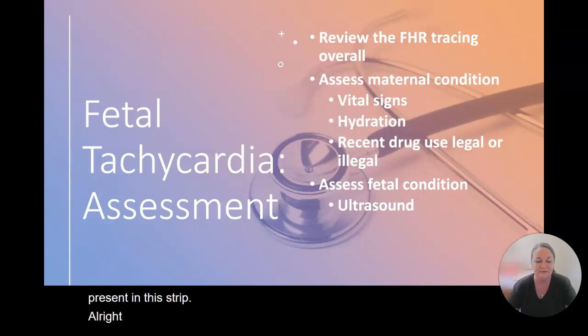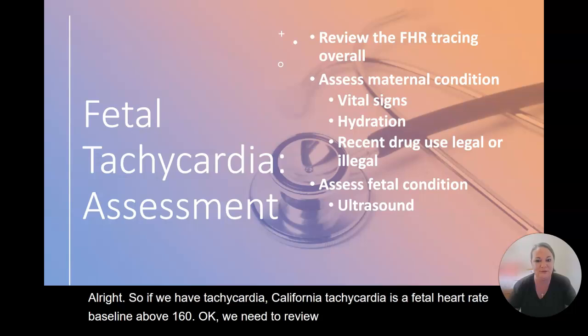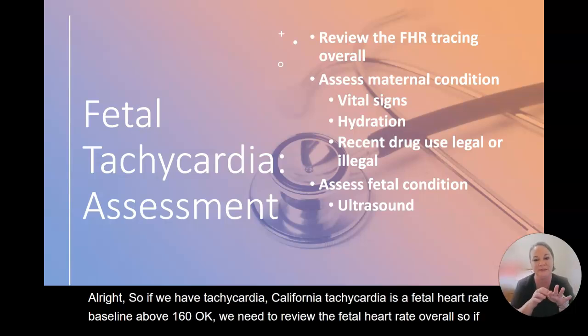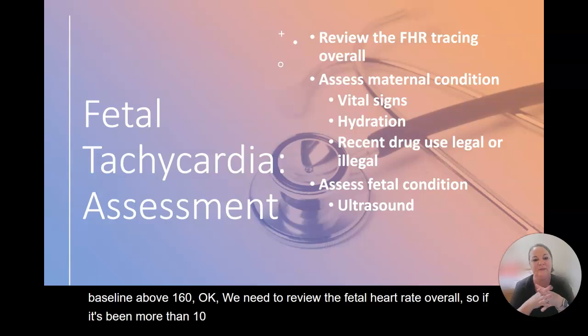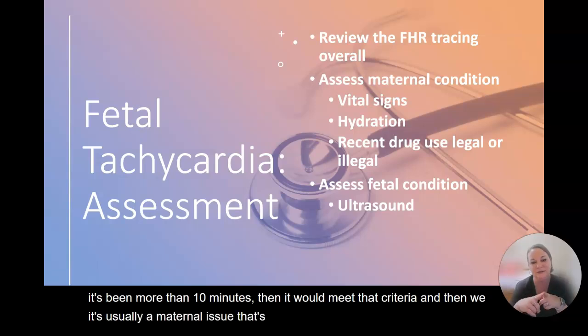All right, so tachycardia is a fetal heart rate baseline above 160, okay? We need to review the fetal heart rate overall. So if it's been more than 10 minutes, then it would meet that criteria. And then it's usually a maternal issue that's causing this. Usually she has a fever, okay?